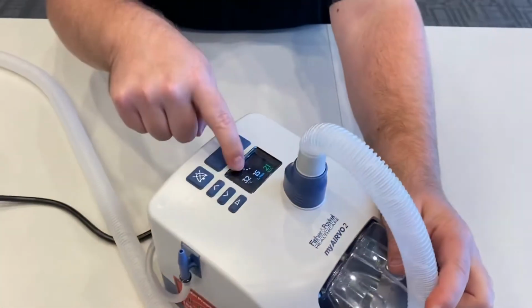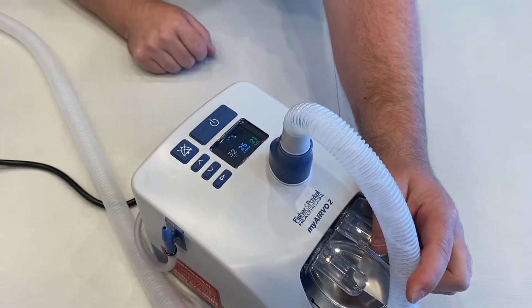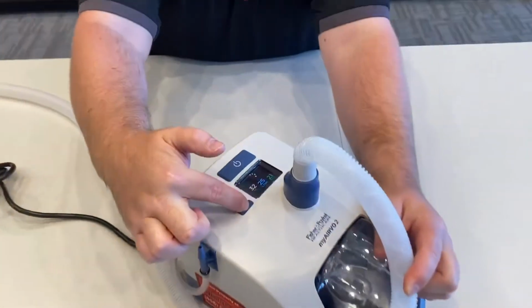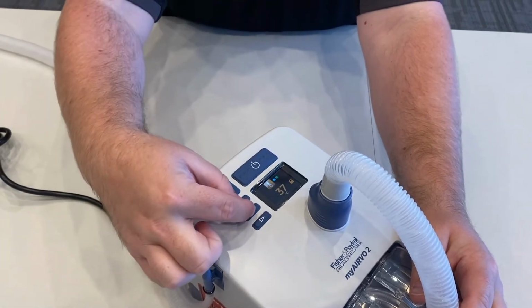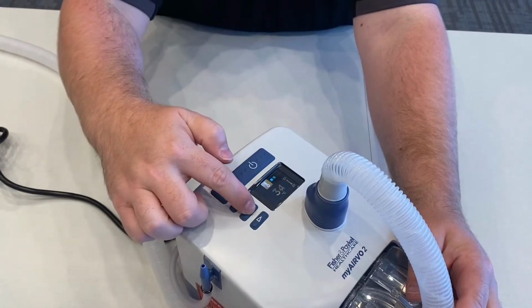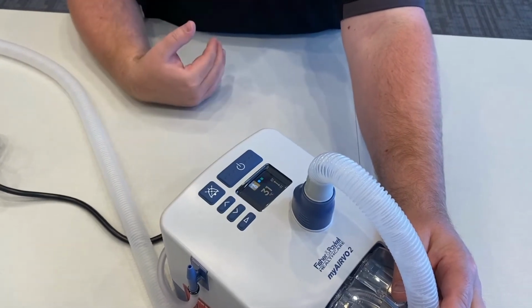You'll see a temperature setting, you'll see a liter flow setting, and finally you'll see the amount of oxygen being given to the patient. In order for us to change any of those settings, we'd have to hit this little play menu. So we hit this play button, and we can change either the temperature. If we want to change that, all you have to do is hold both up and down arrows at the same time, and you'll see that this unlocks that, and we can adjust those settings by 3 up or down, from 31 degrees Celsius all the way up to 37.